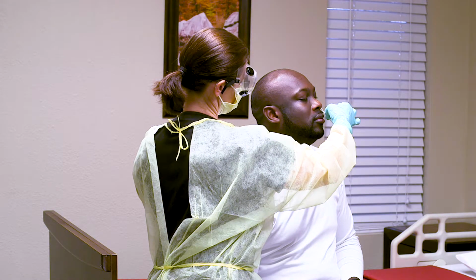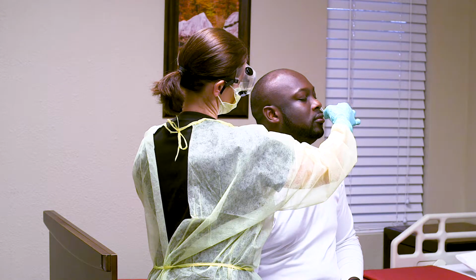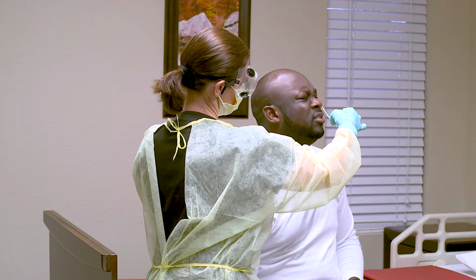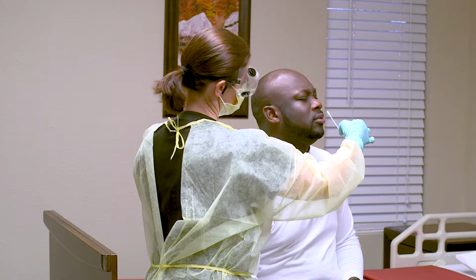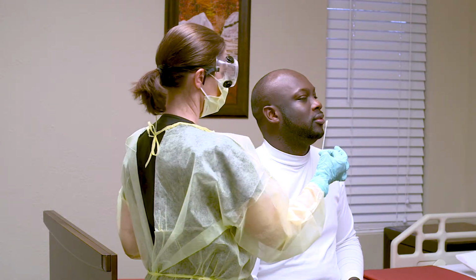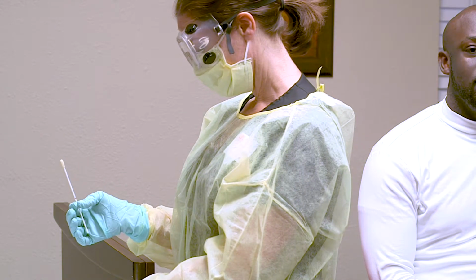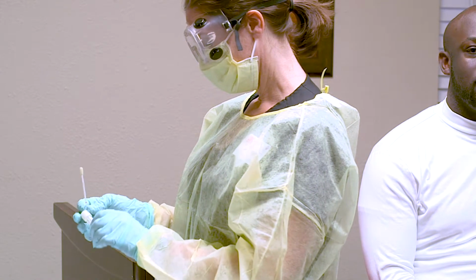As a point of reference, the swab should be inserted about half the distance from the opening of the patient's nostril to the ear. Rotate the swab several times and then gently remove the swab. Perform the test according to the manufacturer's instructions. Unscrew and remove the cap from the eSwab tube, making sure not to spill the medium.